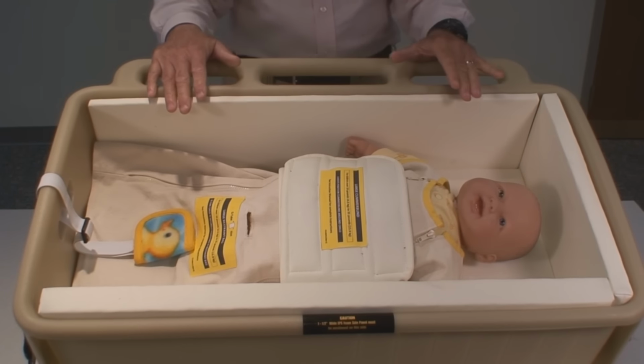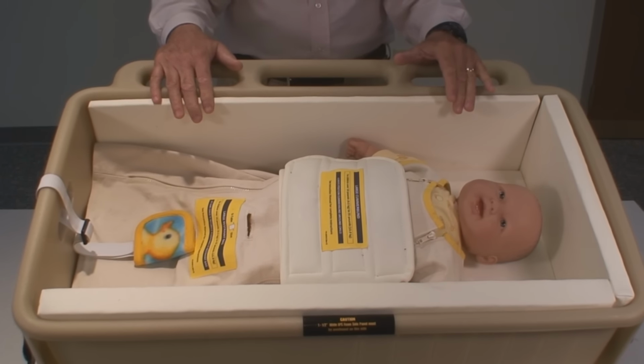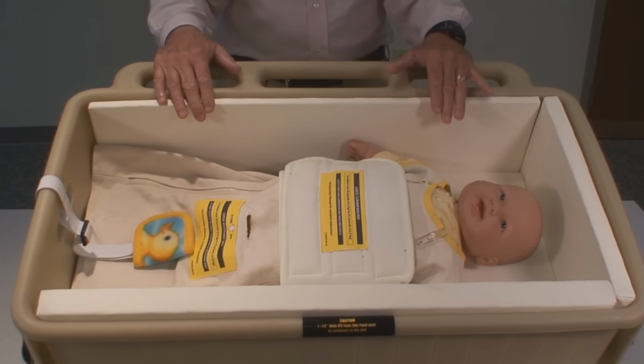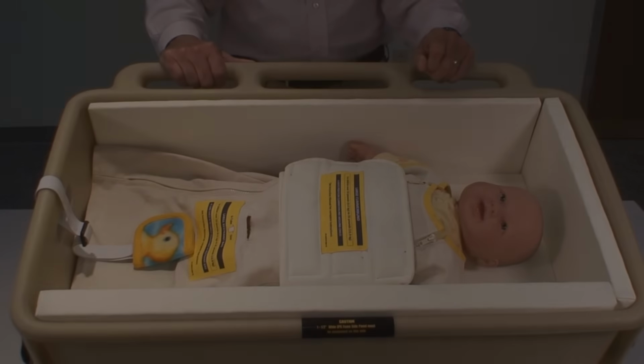It has 5 different methods of restraining a child. You can restrain him in the sleeping bag, either in the supine position, which is on the back, or in the prone position, which is on the stomach, or you can restrain him in the supine position on their back or on their stomach in the 3-point harness. In addition to that, we also have side-facing restraint bags if the child has to ride on its side.